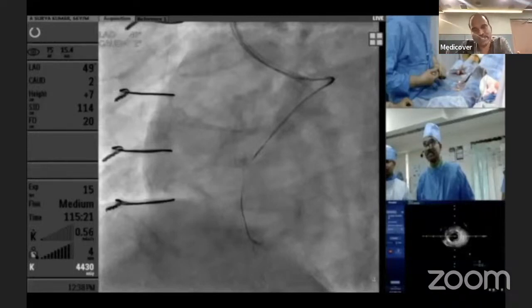You dilate beyond the distal cap, and that is most important. See what exactly happens when you dilate beyond the distal cap. In your dilatation, you are going to create some fenestrations in your flap beyond the distal cap, and those fenestrations will become a microchannel in your next sitting, which flows through your subintimal zone. So in the next sitting, your procedure may become a simple antegrade.